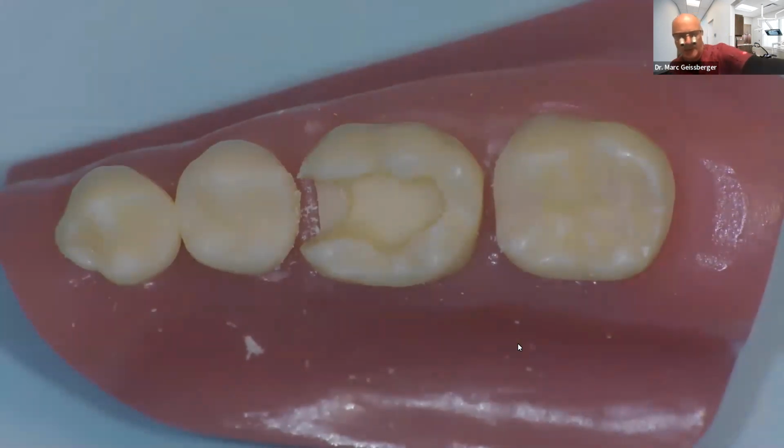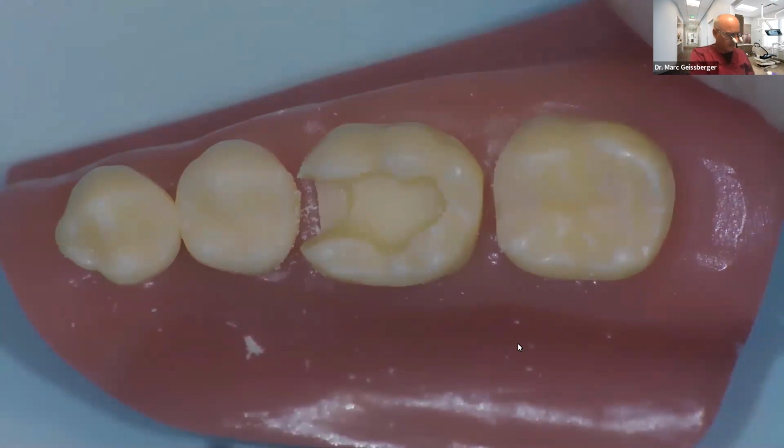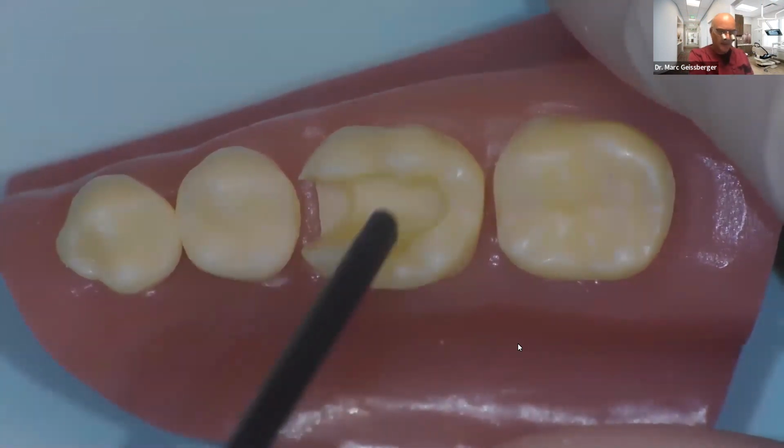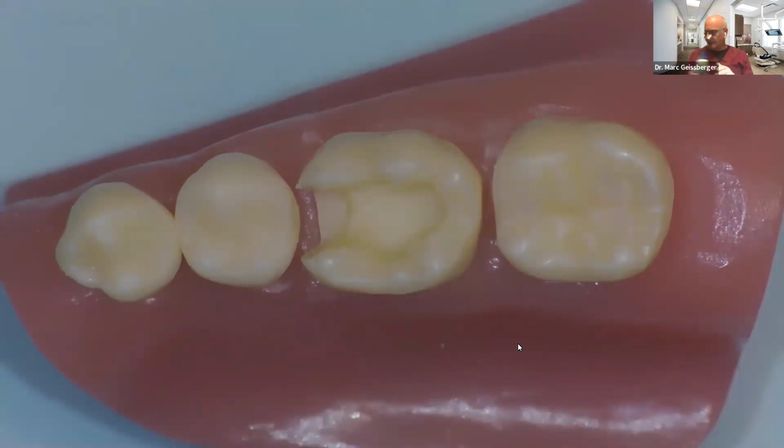I'm going to go over here and grab a little air, and I'm going to just express a little air to clean up my preparation there. Okay, with that said, I'm now ready to place my sectional matrix band. Now, I want to go over some of the critical features in placing a matrix system. The first is height selection.